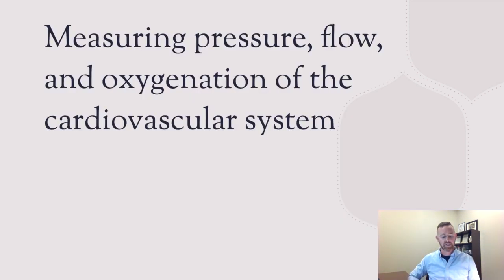So when we do hemodynamic monitoring, essentially we're measuring pressure, we're measuring flow, and oxygenation of the cardiovascular system. So some important things that we would measure would be cardiac output, so how much blood is being pumped every cycle per minute, essentially, is how we measure that.